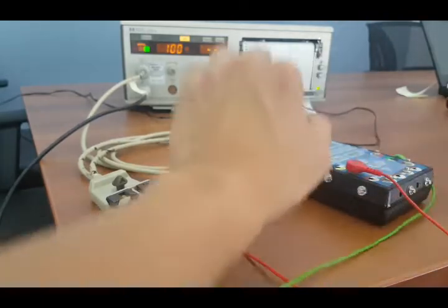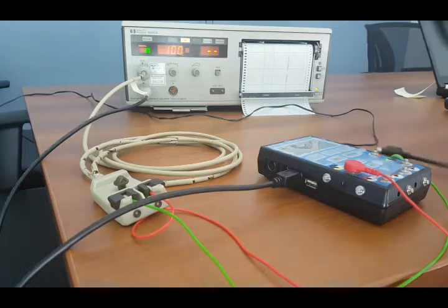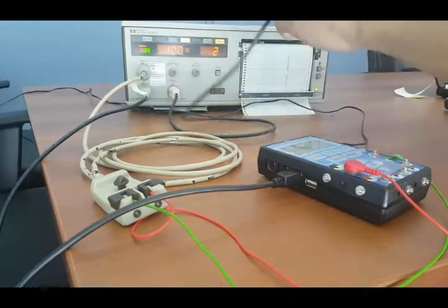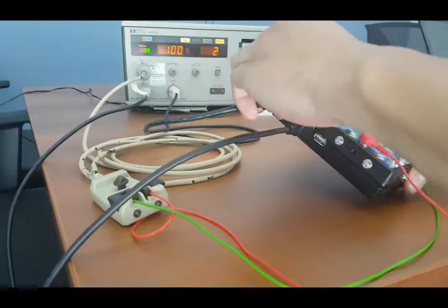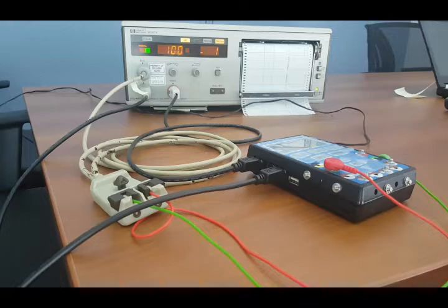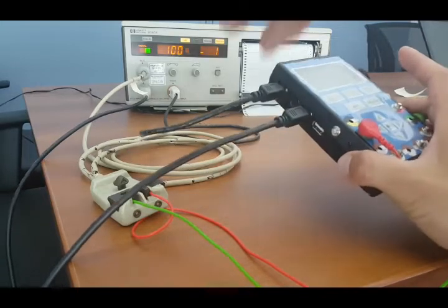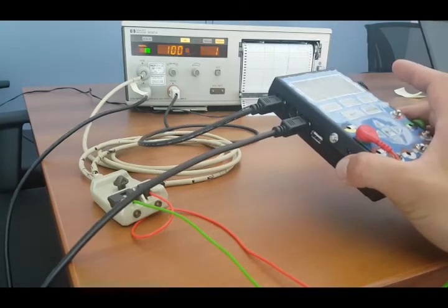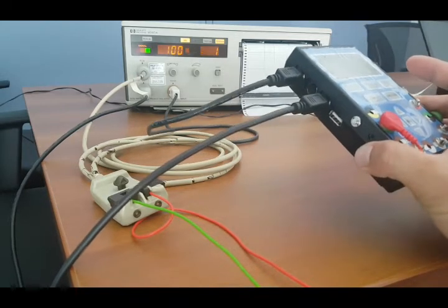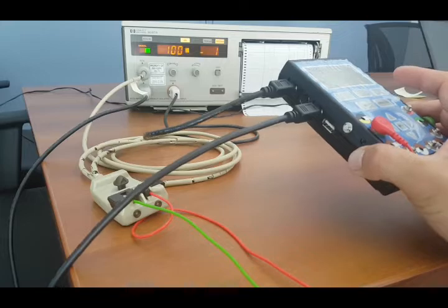Now, I'm going to connect my Toco cable, and I'll put this into US3. The US3 port is also a multifunctional port, so that can receive or output the signal for your ECG signal, for your ultrasound, as well as part of the Toco simulation.